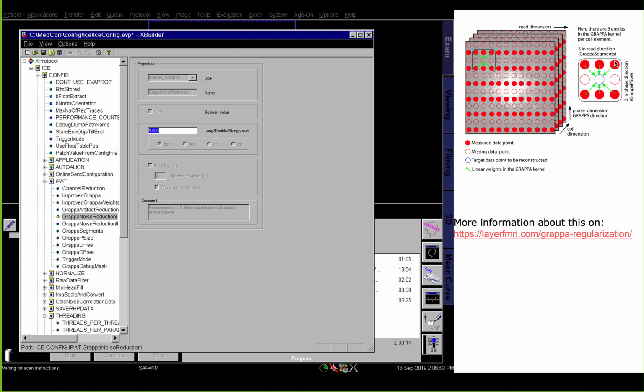And then later in the reconstruction, we try to recover the non-acquired information based on proximity relations, because usually k-space of individual coil elements is rather smooth, and this means that you can recover missing information by relationships to the signal intensities and phases in the close proximity.